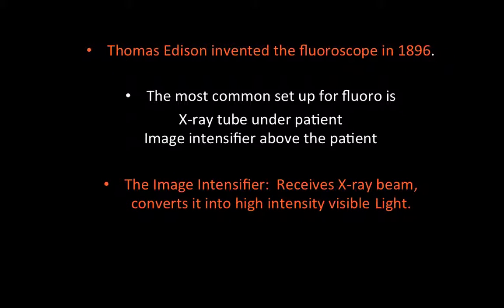Thomas Edison invented the fluoroscope in 1896. The most common setup for a fluoroscope, like I said, is the X-ray tube under the patient and the image intensifier above. The image intensifier receives an X-ray beam and converts it into high sensitivity, high intensity visible light.